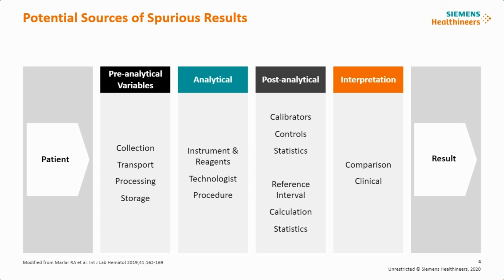But a common theme tying these 4 pillars is proper clinical history. So you'll hear me talk about clinical history in patients throughout this presentation, and the importance of establishing proper lines of communication between both the laboratory and the clinical service.